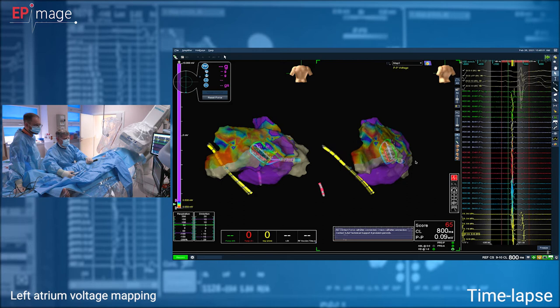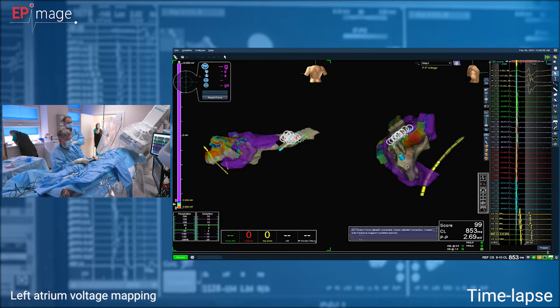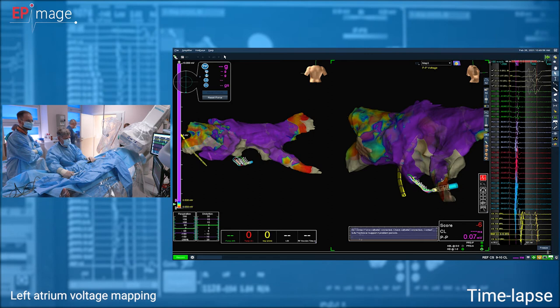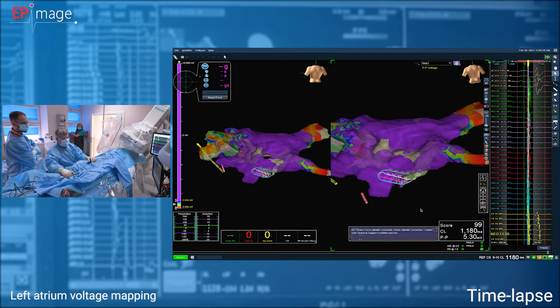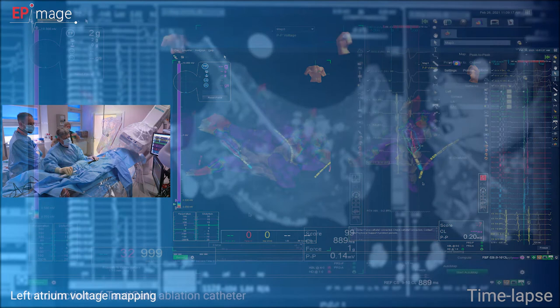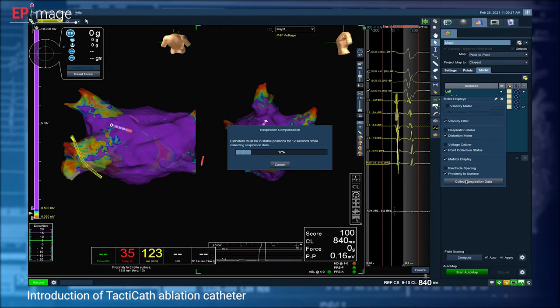So generally, what we are creating is not only a three-dimensional geometry of the left atrium and pulmonary veins, but we are collecting all electrical points. Our thresholds can be seen on the left bar, so everything below 0.05 millivolts will be treated as a scar, and everything above 0.5 millivolt will be treated as electrically healthy myocardium.